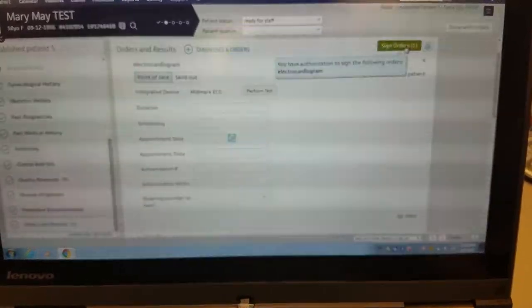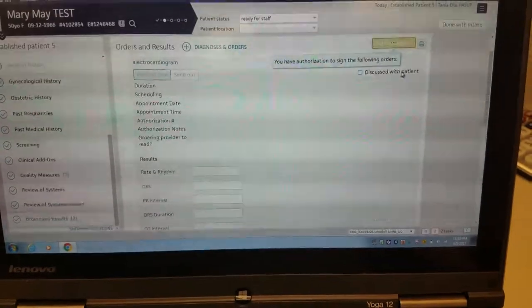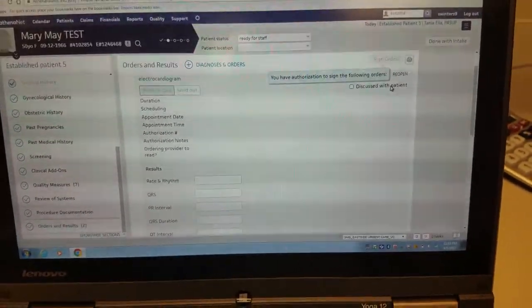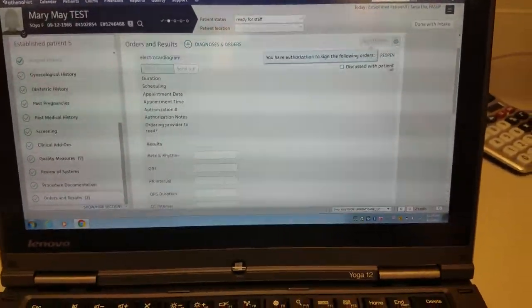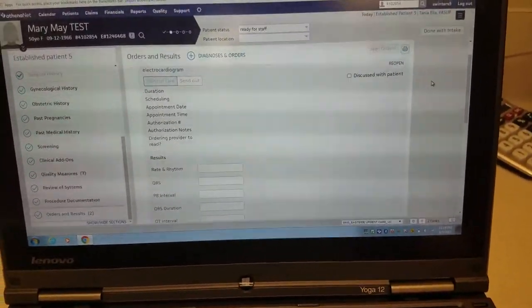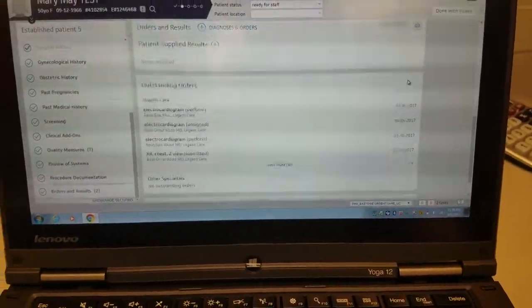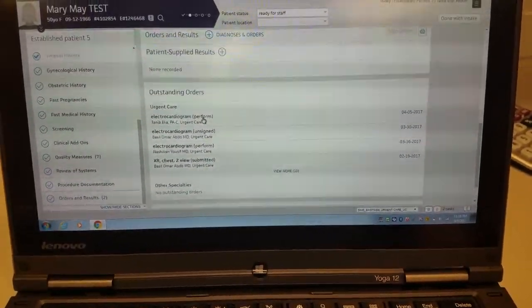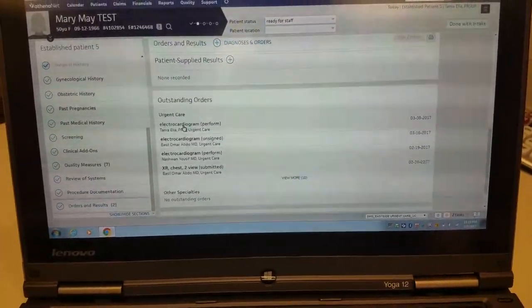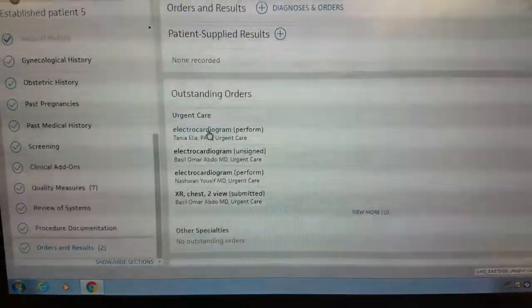If you were adding it in, you would add it in and sign it. But for the most part, the provider orders it. So then you would work on it. You would open up your EKG under outstanding orders.